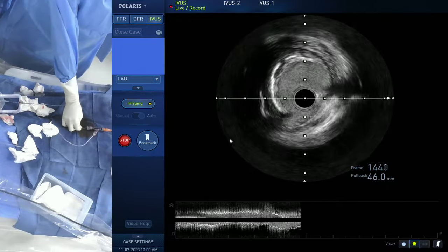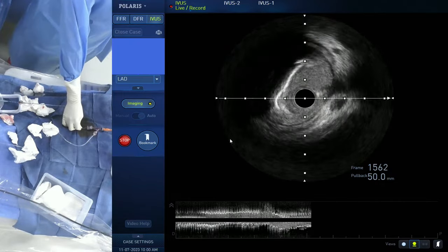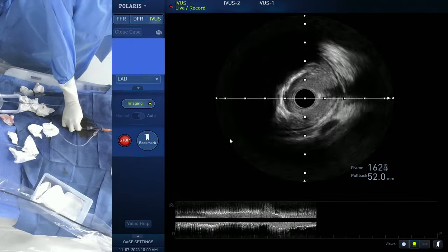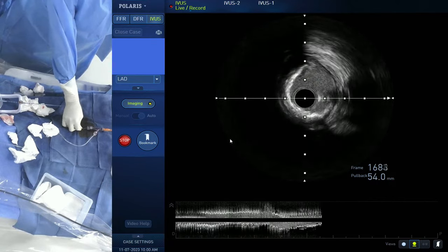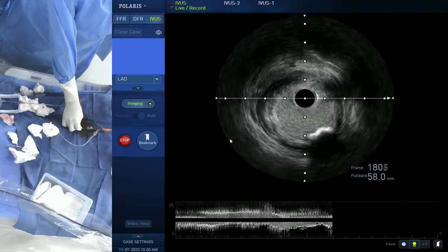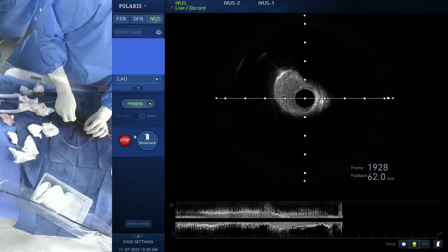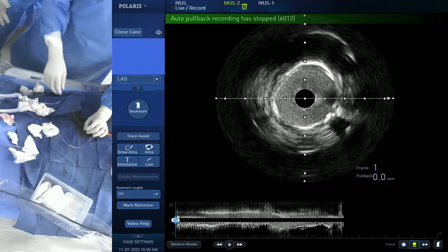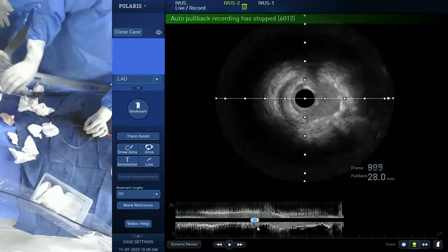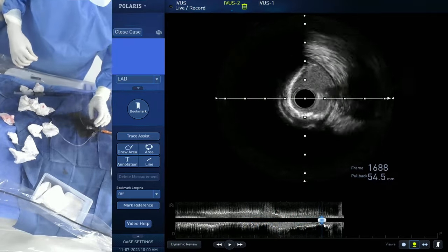So we show the 3.5 stent, right? Yeah, we can try. So few cuts. Yeah, much bigger lumen. One cut. You have a few cuts. Yeah, some calcium fracture. I can see that. Nice IVL cuts. Okay, 3.5 by 16. I'm 15. 15 or 18. 18 probably.